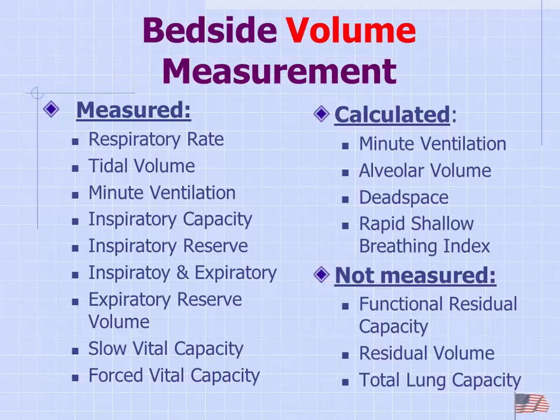Rapid shallow breathing index is an index that we use at the bedside to evaluate somebody's spontaneous ability. This is the value that we monitor while they're spontaneously breathing prior to being extubated. Okay? It's the frequency to tidal volume ratio, so I see what the frequency is divided by the average tidal volume in liters, and we can get an index of whether or not they're ready to be extubated.